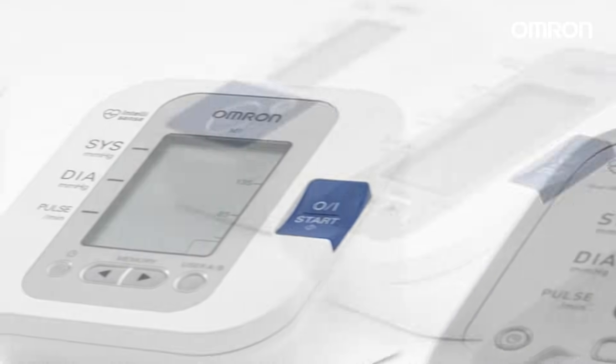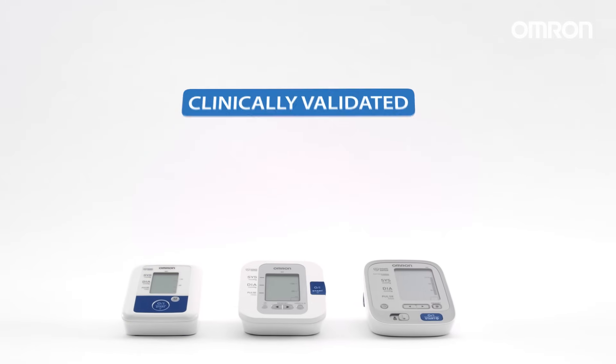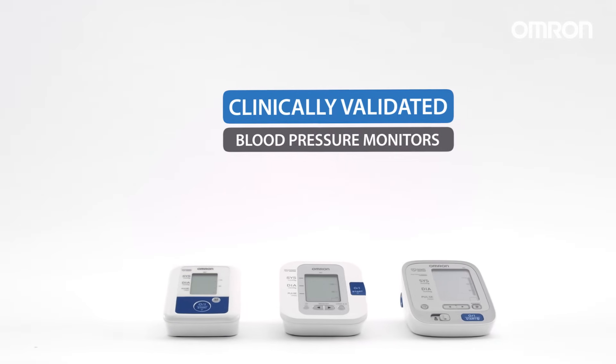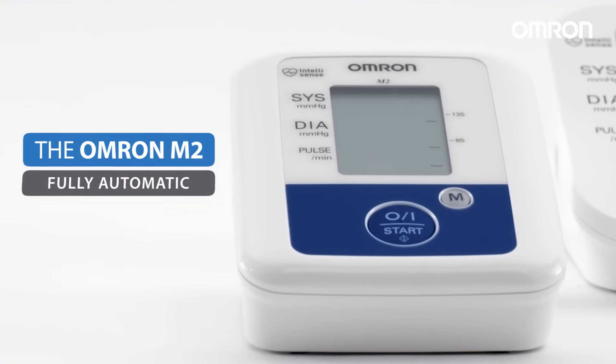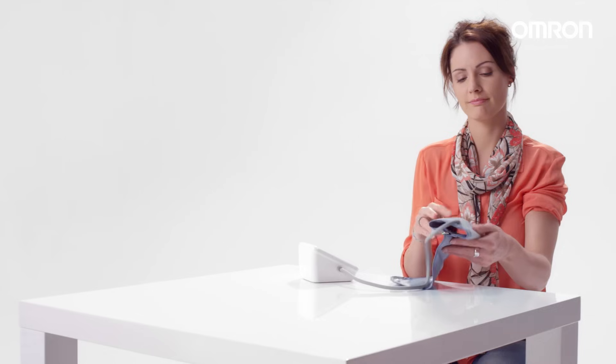Regularly checking your blood pressure plays an important role in maintaining a healthy lifestyle. All Omron monitors have been clinically validated. Omron's M2 model is a fully automatic upper arm monitor which ensures readings are both convenient and accurate.